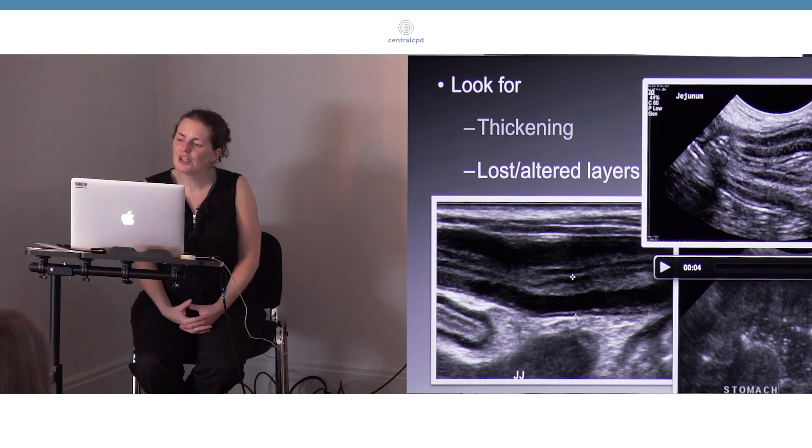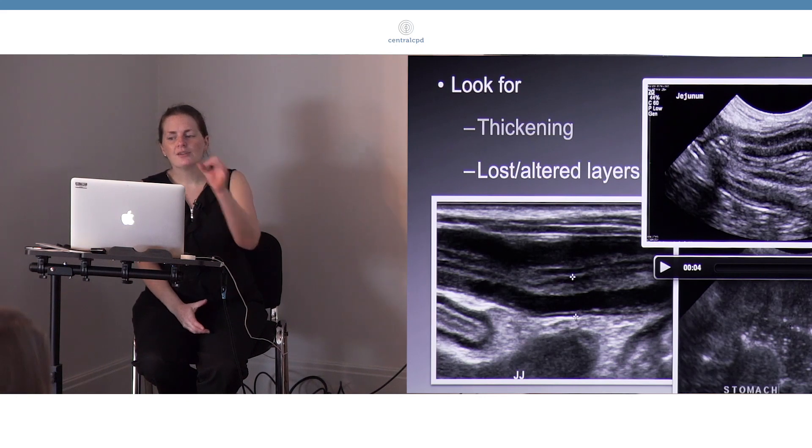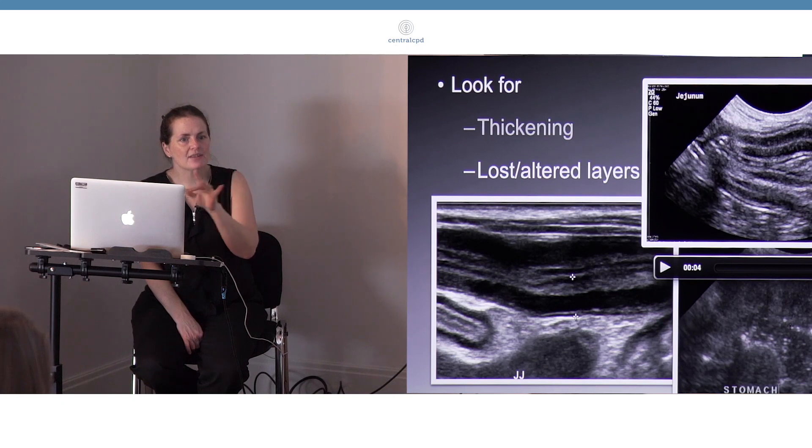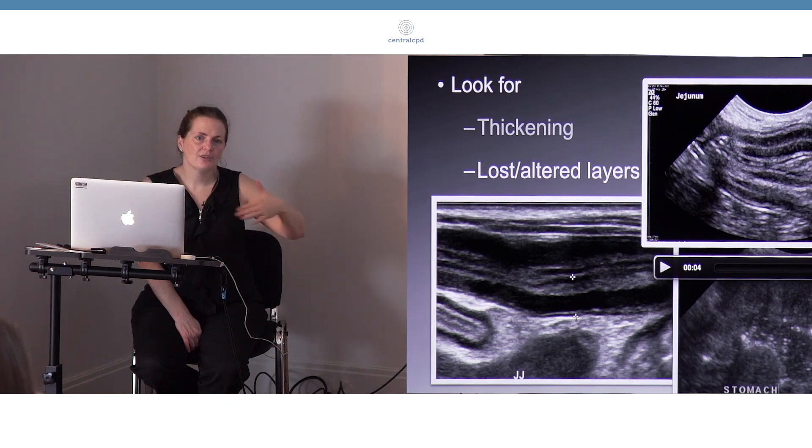Now this is something we associate with dilation of the lacteals. We see that with a variety of different things, doesn't necessarily mean pathology. But in particular, we do see it associated with lymphangiectasia, so it's certainly a feature to look for. Also, some cases of IBD will have a degree of speckling of the mucosa.